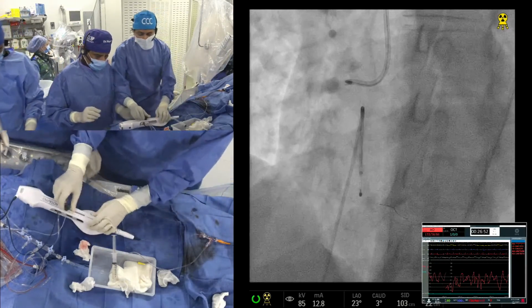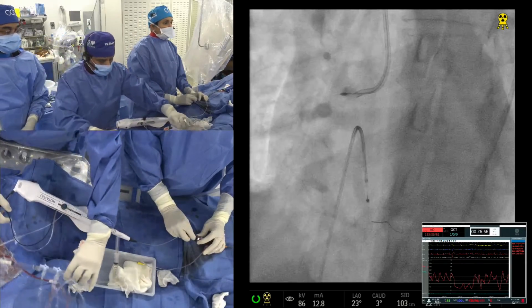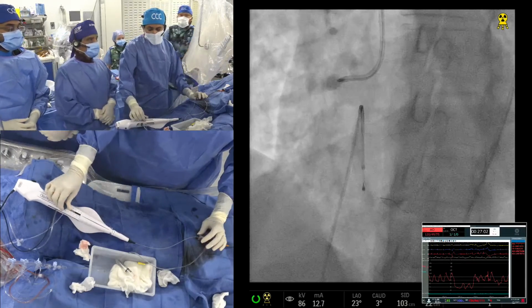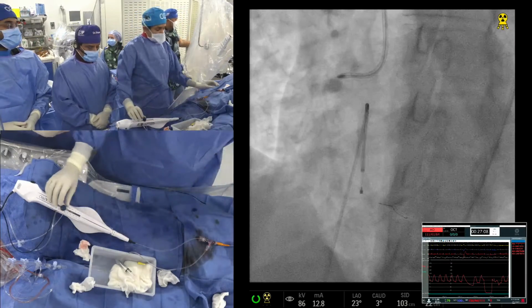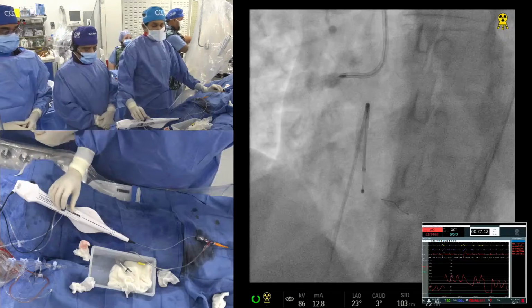Okay. So if you see that, Samir, you see how the guide is giving us trouble. Yeah. So you stay there, and if need be, I will need Dynaglide just to enter the vessel. But right now we are okay. I'll finish my 3 steps. Tap Dyna, and then let's see.